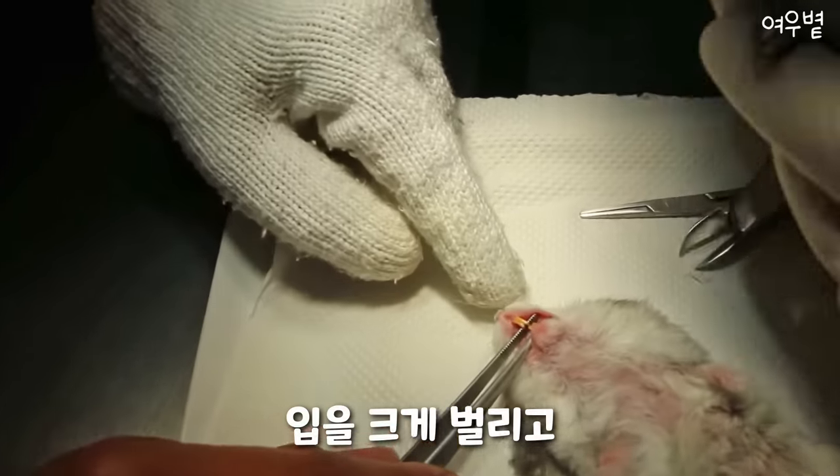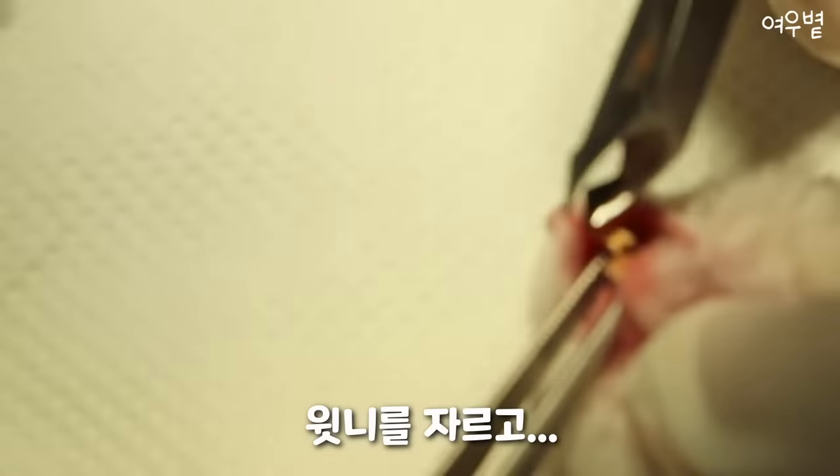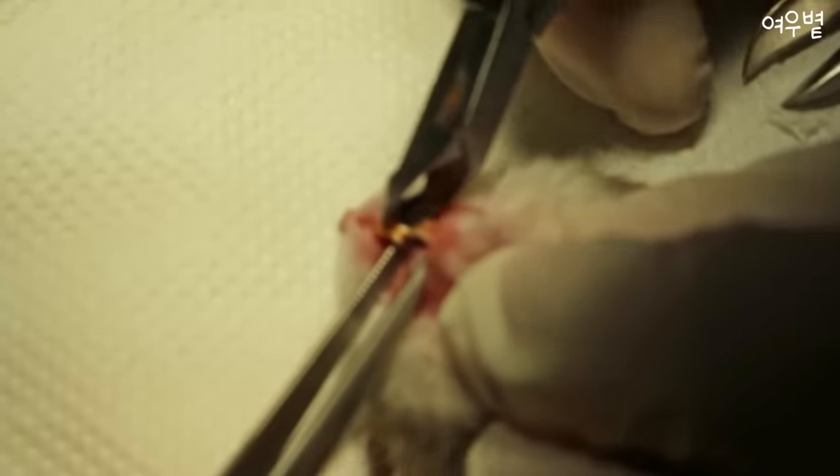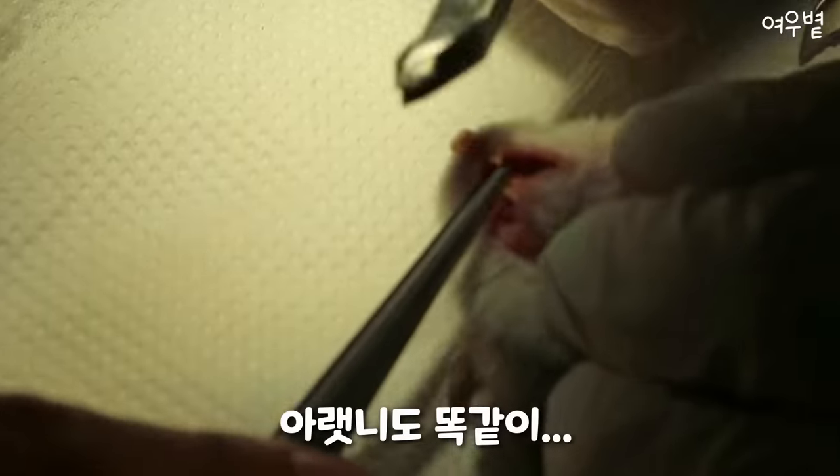Okay, let's see. Open up here. Yeah, there seems to be a fracture there, actually. So, trim. Trim, yeah. Okay, in the lower part.